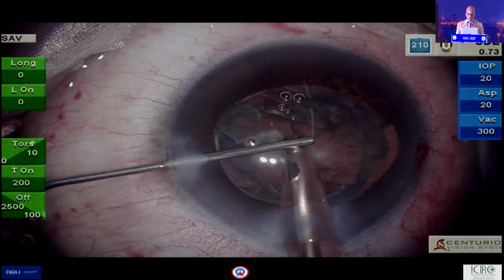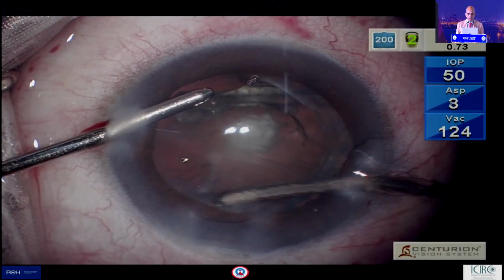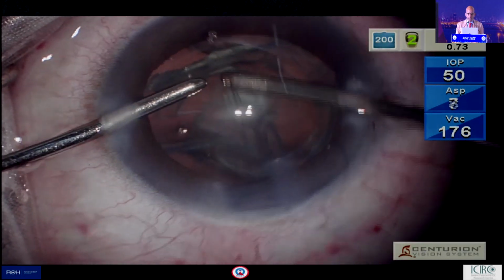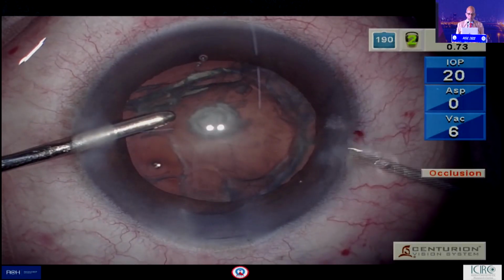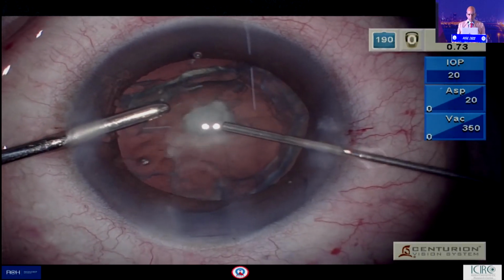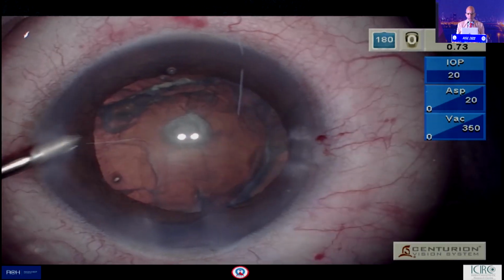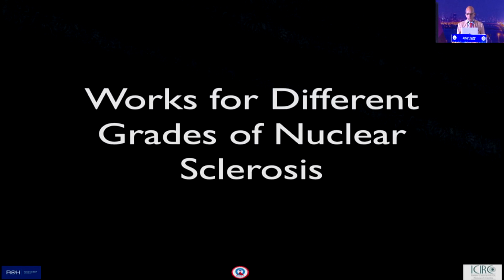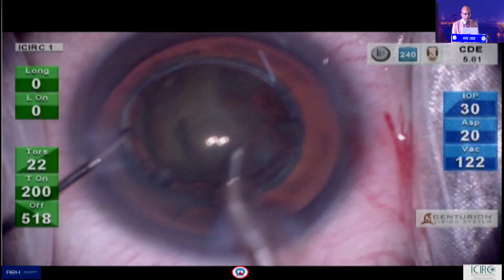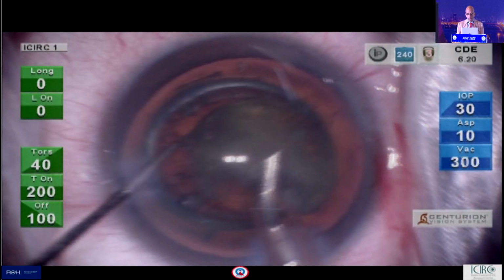Always do subcapsular hydrodissection, but remember, inject Viscoat or something like that. And with the bimanual technique, it's not difficult to produce total removal of the cortex here. Once again, swap the instruments and perform that. Now, the best part of these principles that we just went through is that you can deal with any degree of density or any integrity of the posterior capsule.